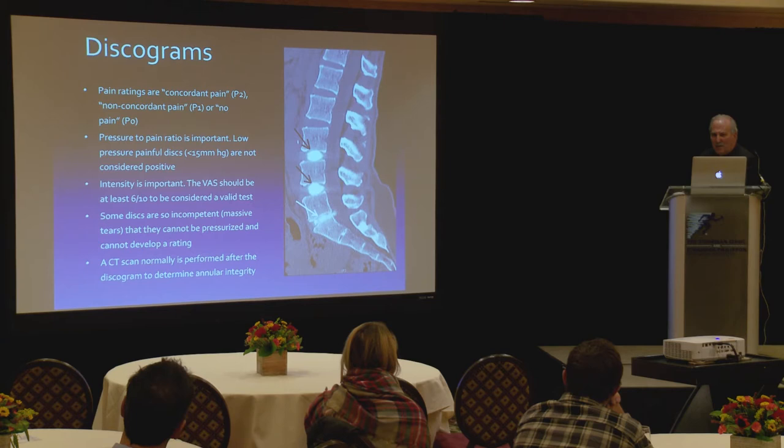So Dr. Evans will take a patient in, put them to sleep, give them sedation so they're out, drop needles into their spine, and then wake them up. Once the needles are in, you don't feel them. So they're relatively pain-free when they're woken up. And then he's going to interrogate the disc by attaching a syringe with a manometer to tell him pressure, and he's going to literally pressurize the disc while the patient's awake. So we're looking for reproduction of back pain.